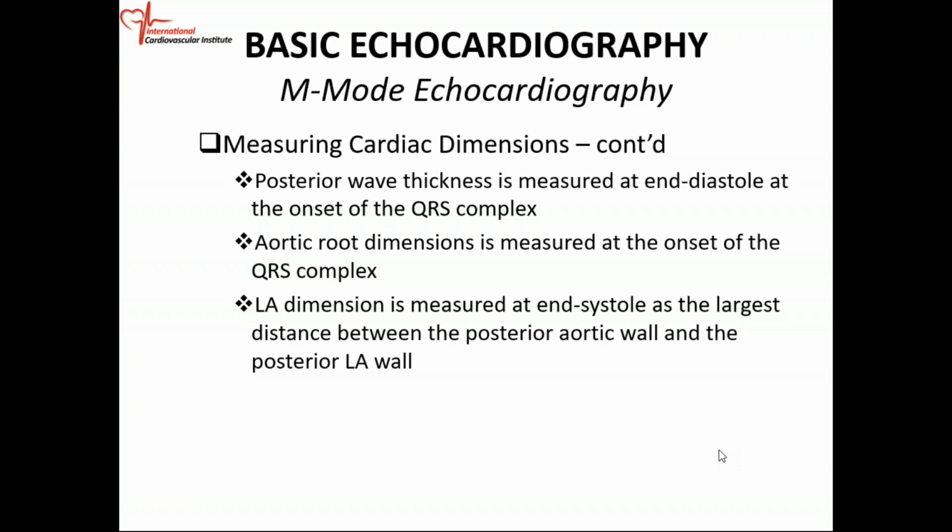Again, M-mode is one of those things that you should understand fully, because it's not a lot. You're not dependent solely on M-mode for anything, so they'll just bring a few basic things. You have to know the normal structures, and you have to know where you do your measurements. And then when we go into pathology, you can see the difference between your pathological M-mode and your normal M-mode. All right.